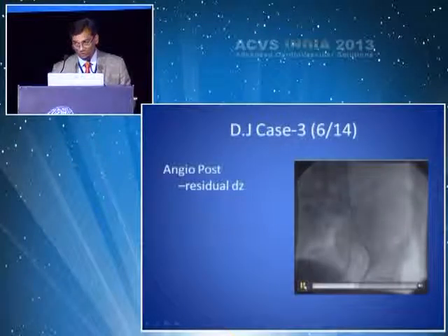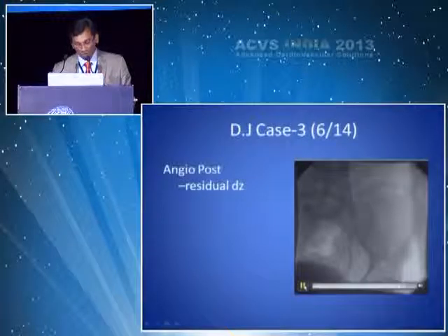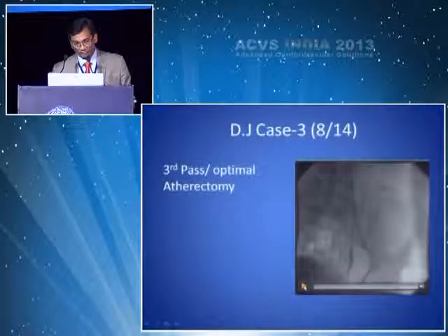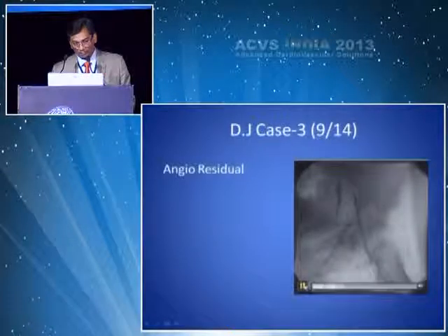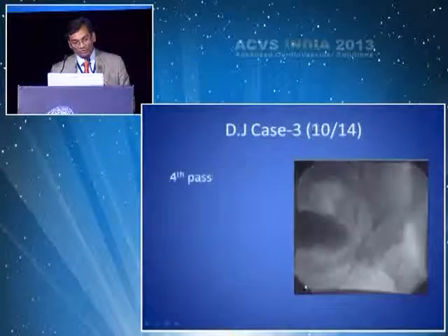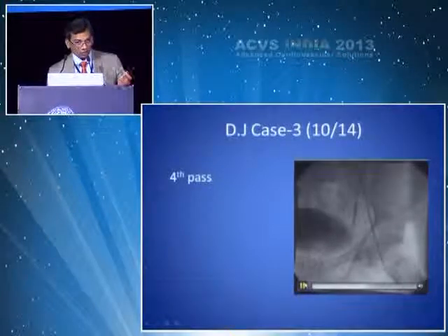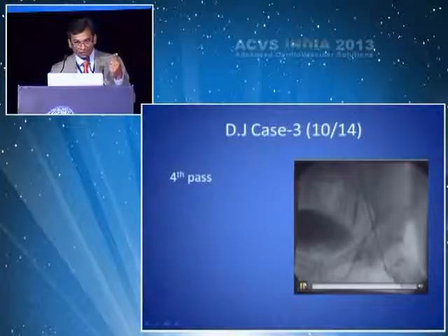Because of residual stenosis of more than 30–40%, we continued to do a second pass, a third pass, still some residual, so we went with the fourth pass. And then Silverhawk, this is another thing.